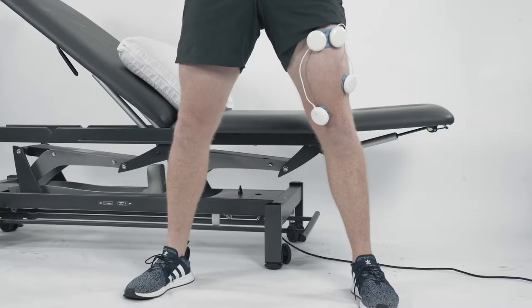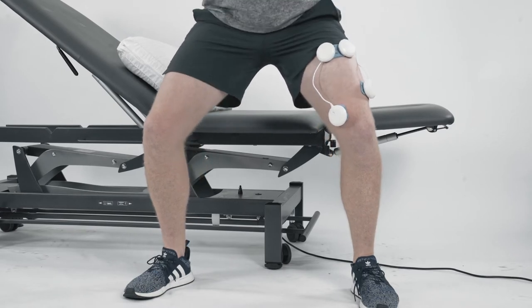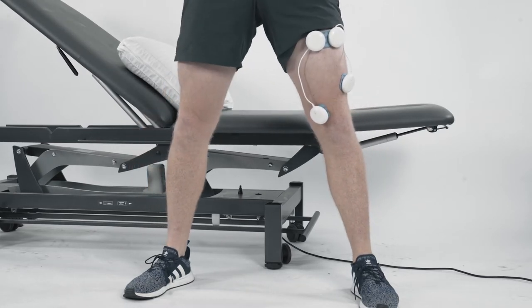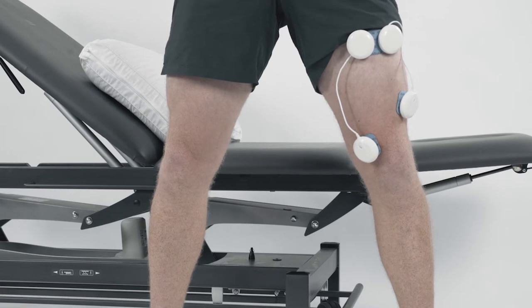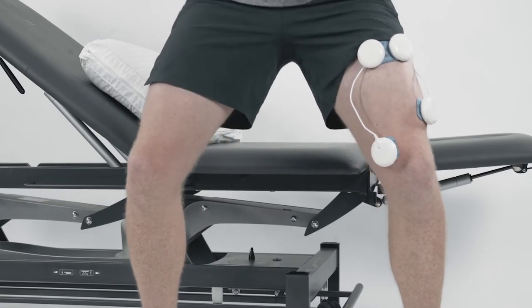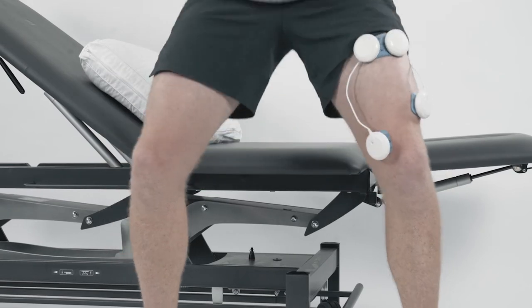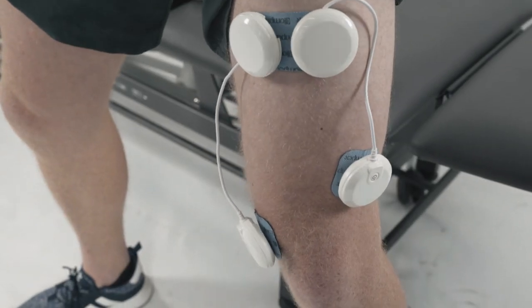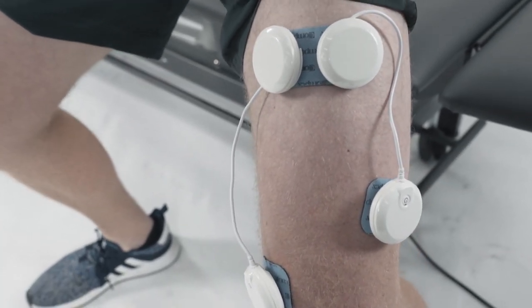Depending on the patient's recovery and how they're progressing through their rehab exercises, you can progress the mini squat to a deeper squat or a goblet squat. We have our electrodes over VMO and VL and the reference point on rectus femoris. We're again asking the patient to squat actively during the active phase of the treatment program and then relax throughout that relaxation phase. With a deeper squat, you're limited to the number of squats you can do during the active phase. For most patients, they'd get one to two squats out per cycle, and then through that relaxation phase they will just rest and recover.